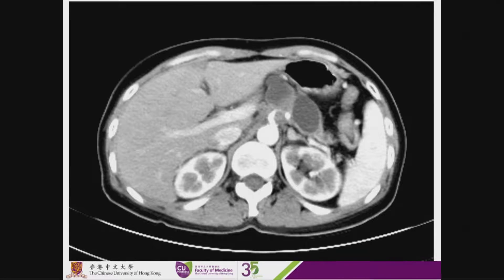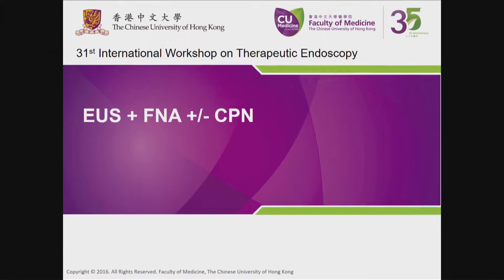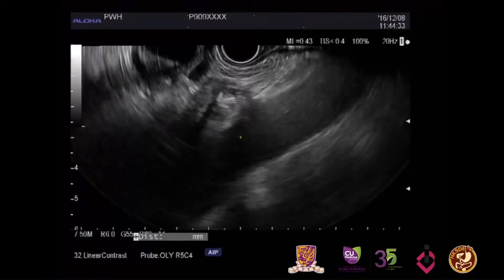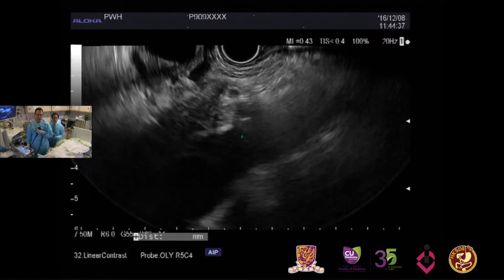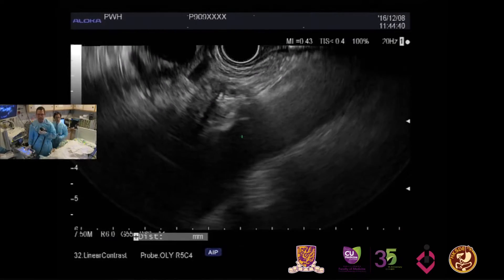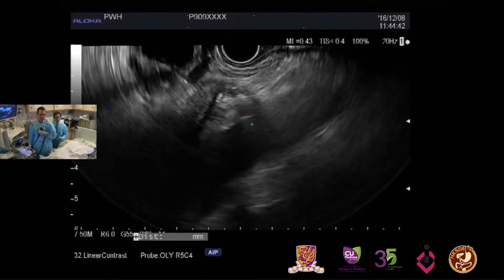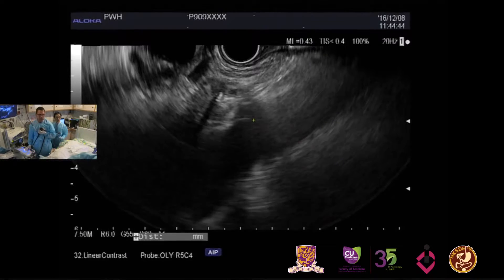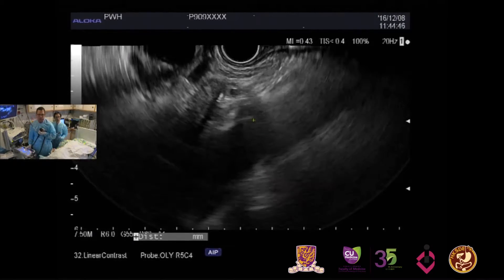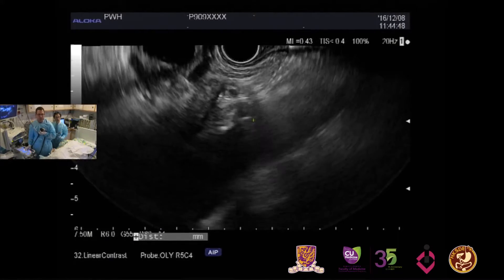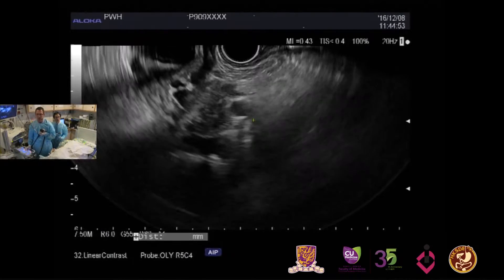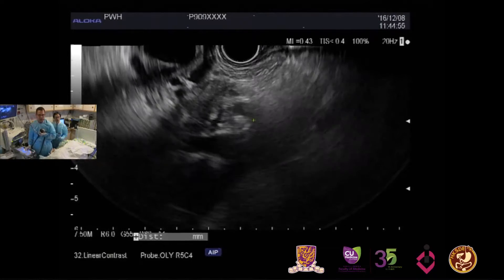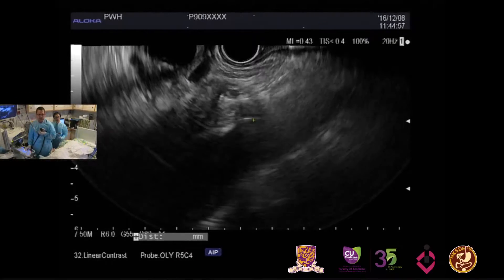This is the CT scan. Today we're going to do EUS plus FNA plus a minor celiac plexus neurolysis. We have a solid and cystic tumor which appears to be involving the celiac, and we see the exact same findings on the endoscopic ultrasound. That's quite common now with very high quality CT scans. The main role of the EUS here is for tissue diagnosis.